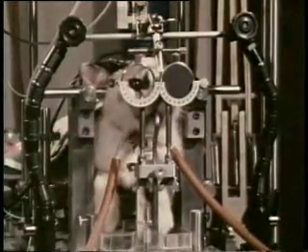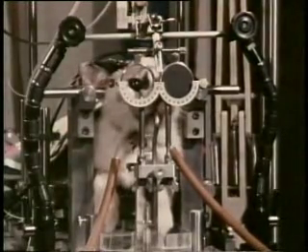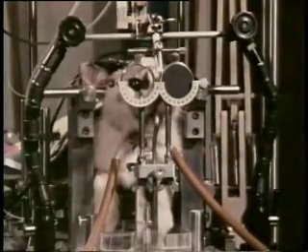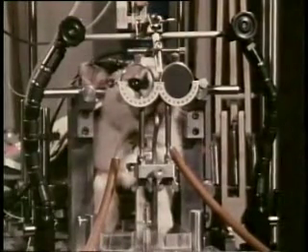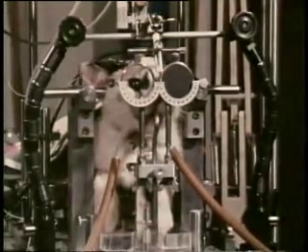Unlike retinal ganglion cells and the cells of the lateral geniculate nucleus, cortical neurons almost never respond to changes in general illumination. Off, on. You can hear that there's no response.